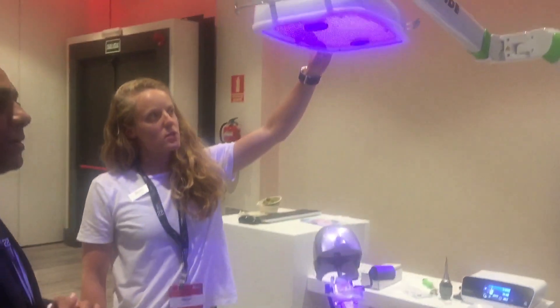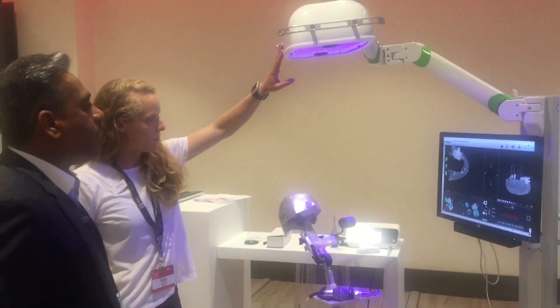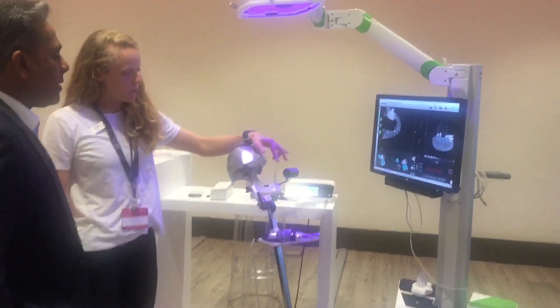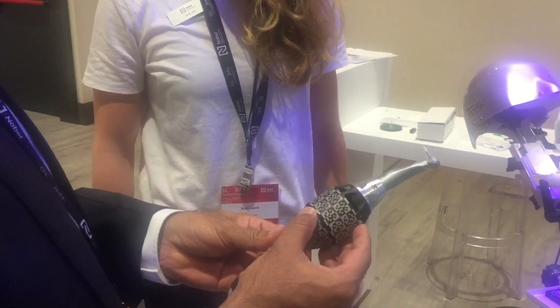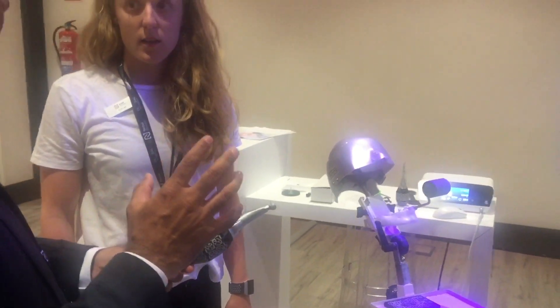It's a dynamic navigation system. We have two cameras located in this lamp above the patient's head, and it's tracking two patterns — there's a pattern on the patient and a pattern on the handpiece. It's like a QR code of sorts. So basically the concept is just like your GPS system, what you use in cars and stuff like that.